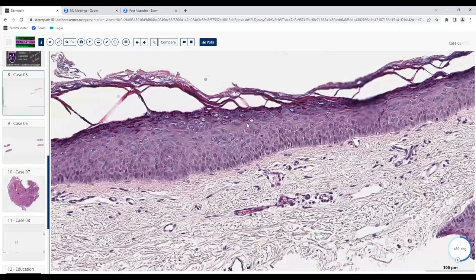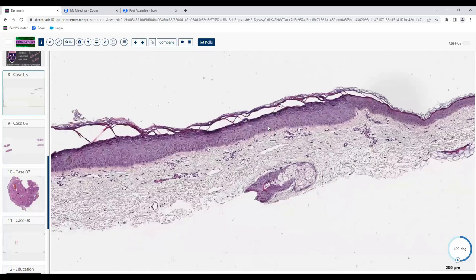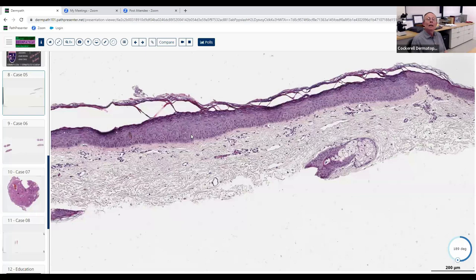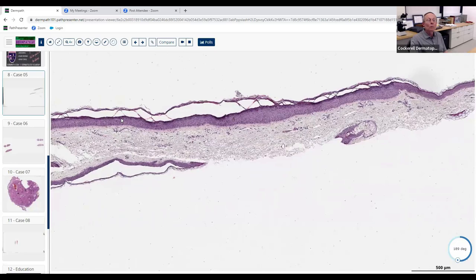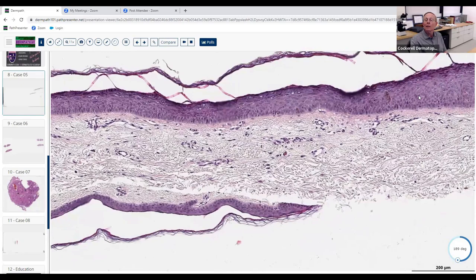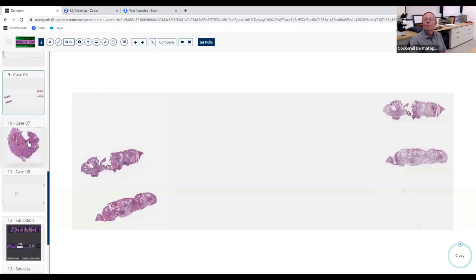Patients with EDV get lots of warts that become confluent, and when you biopsy them they can look like this — or even like fully developed squamous carcinoma in situ with frank atypia and mitotic figures. This patient may have this as a coincidental lesion, but it's a nice example of the classic blue-gray cellular morphology of EDV. Great that you got that.